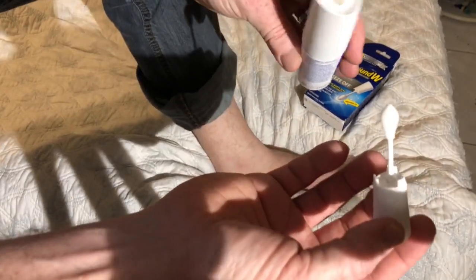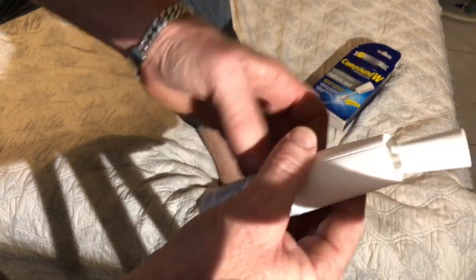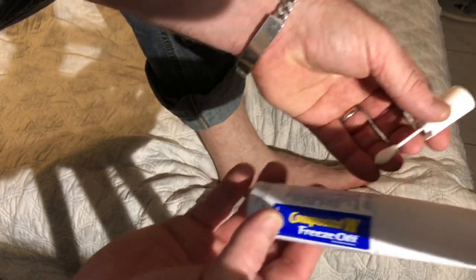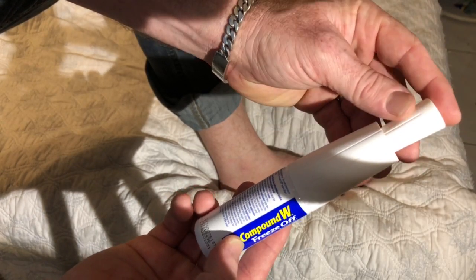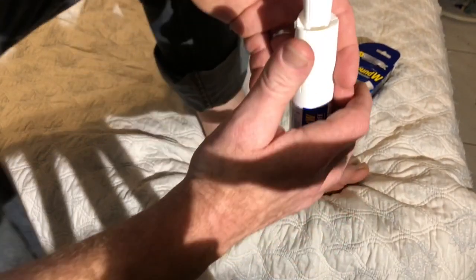You take this and put it in here, then insert it inside like so. Here it's in — push it in. Now I need to hold it upright and hold it down.